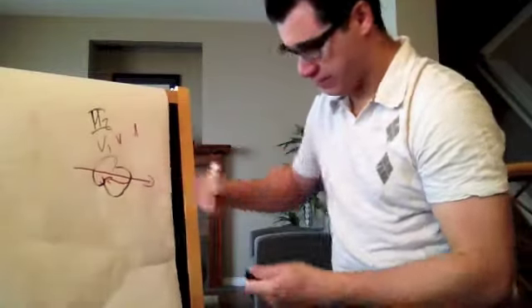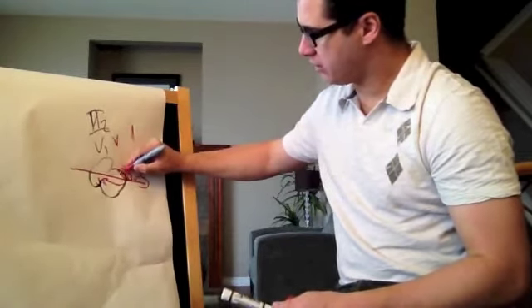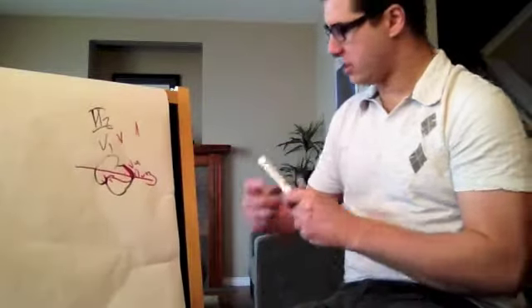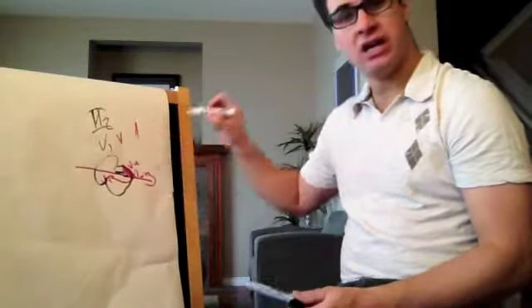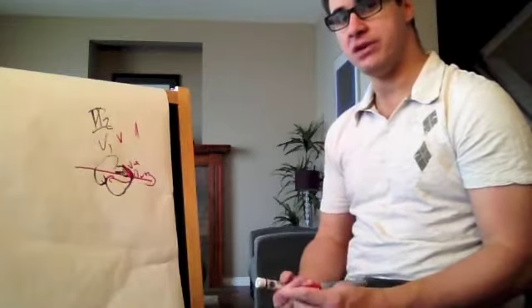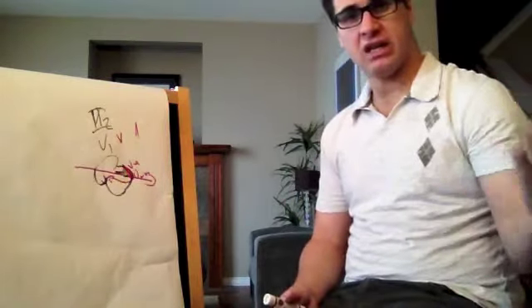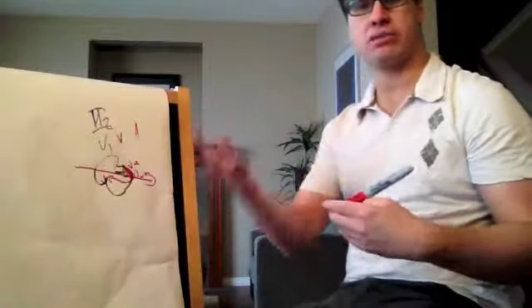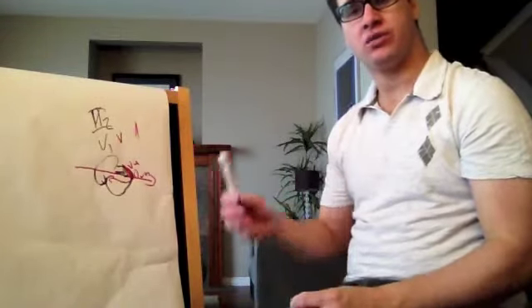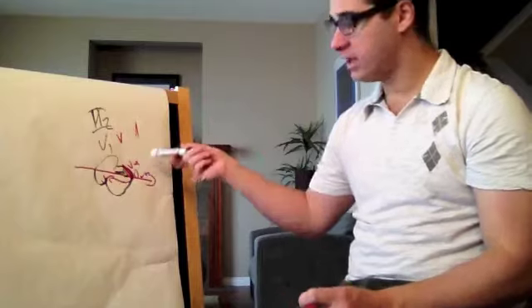No, because leads V3 and V4 are right here. They're checking that zone. What I'm checking is the electricity going this way. So, because there's something cooking right over there, I should be checking that zone. And during one transport I did one time, that's exactly what it was. The transport was an MI patient that was reperfused, so got TNK, and we were transferring because the TNK didn't work. Anyway, we were transporting that patient. Well, I didn't monitor him in lead 2, because what's the point? My point was to monitor him where his MI was. And actually, if I remember correctly, it was V4.